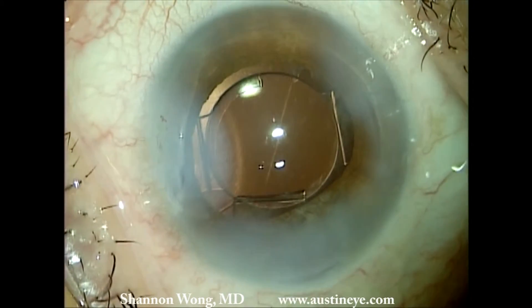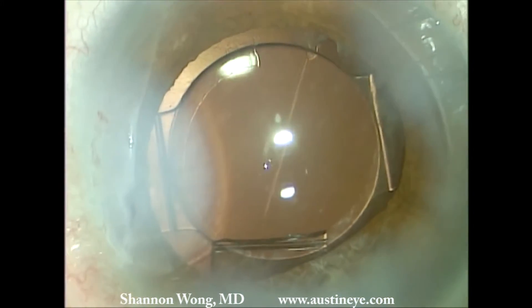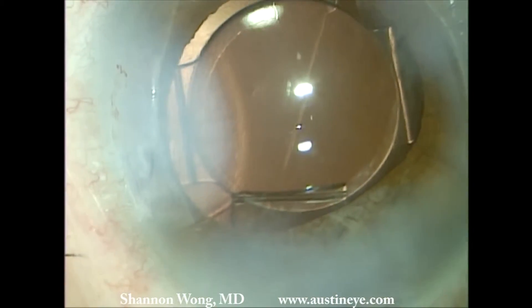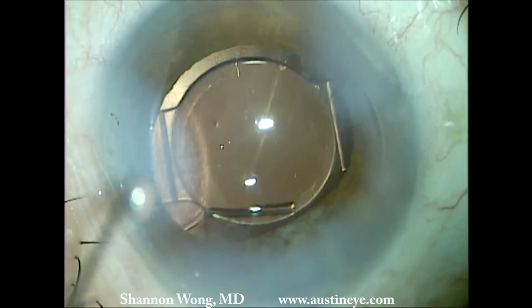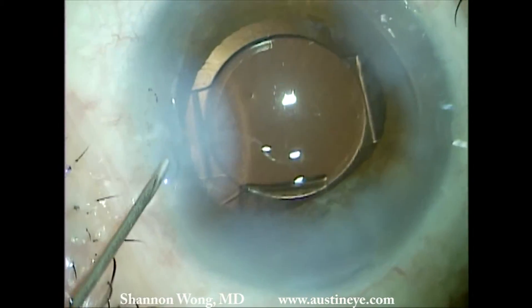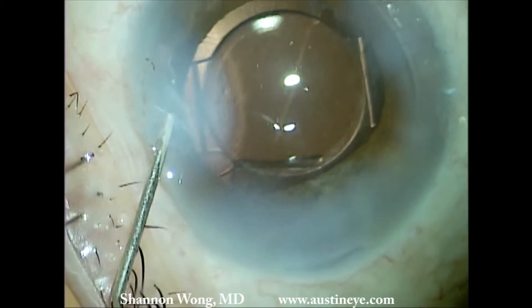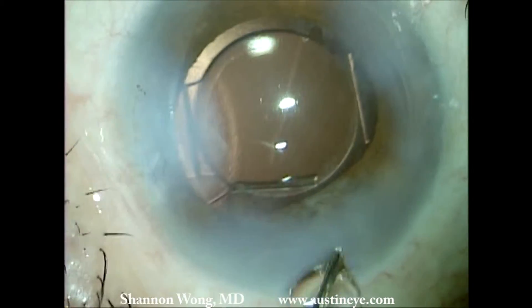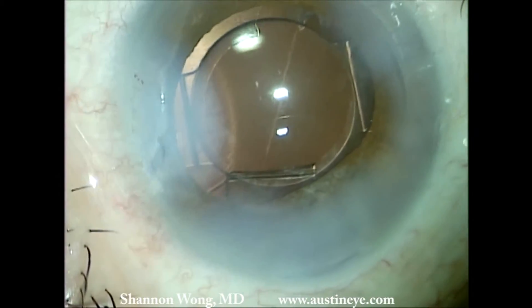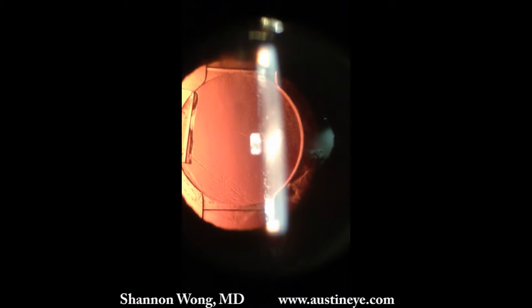We make sure there is a watertight seal to the eye. We double-check and triple-check the position of this lens to make sure it is planar and not in a Z configuration. It is confirmed to be in a planar position at the conclusion of surgery, and we leave one of the haptics in place at the conclusion of the case.